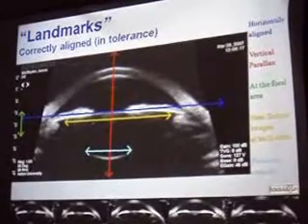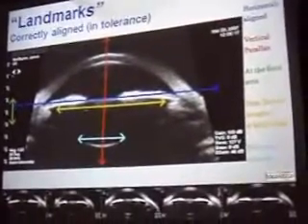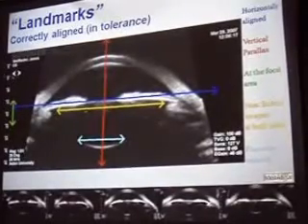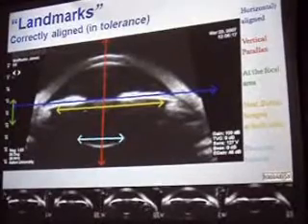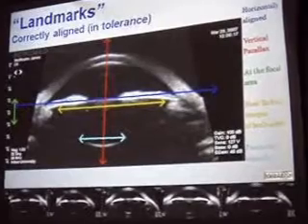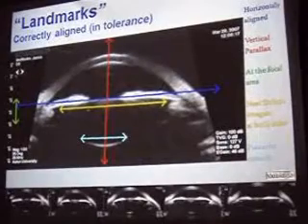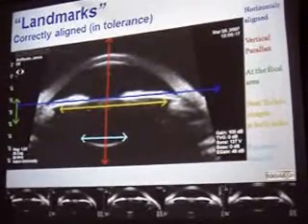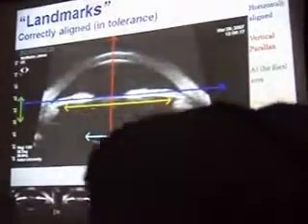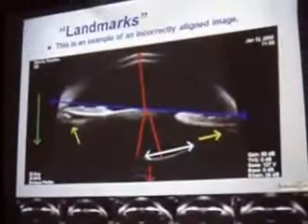Finally, the third landmark, the posterior capsule. The posterior capsule is the ruling one. The posterior capsule acts like a pendulum. When we are aligning through the pupil, the minimum space that the pupil provides us to pass through will give a very good picture of the posterior capsule if we are centered, in the middle of that, and actually aligned. That means we will see the posterior capsule, but we should take the largest posterior capsule image over the clip.